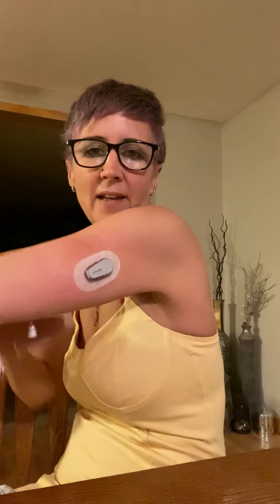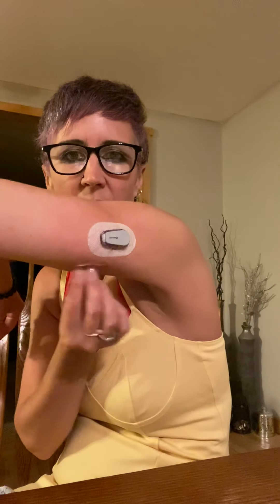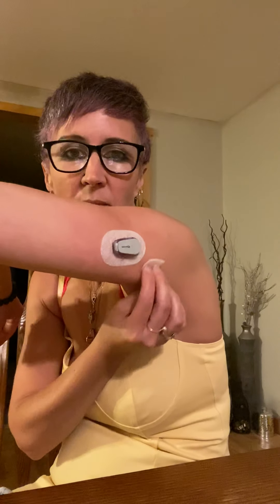So far it looks like the regular part of the Dexcom area is still on and good. I'm going to use my camera on my phone here as kind of my mirror so I can see what I'm doing. It's a little red from where I took off the other one.